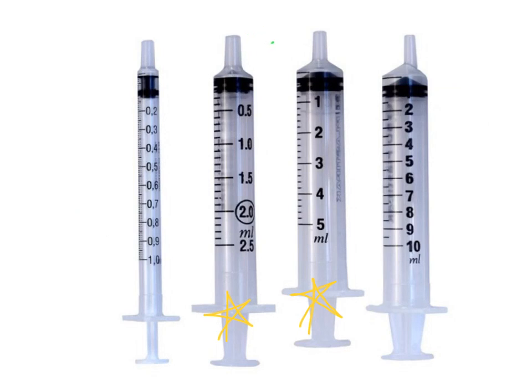Look how on that first one, the longer lines, those longer dashes right here, are counted off in halves. So if I have 0.5 and then 1 and then 1.5 and then 2, look at the distance between 1 and 2 on this syringe. Here's 1 to 2. Whereas look at the difference between 1 and 2 on this syringe. This one, the third one on your screen, is actually very similar. Between 1 and 2, once again we're seeing 1.2, 1.4, 1.6, 1.8, and that's why this is therefore 2.